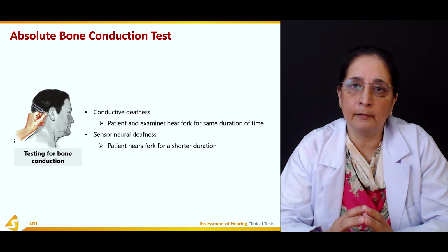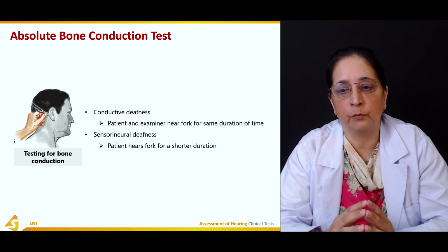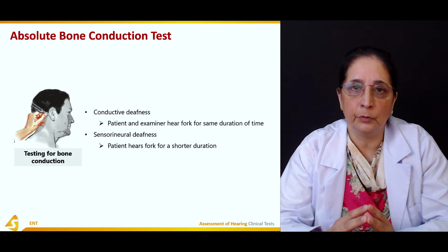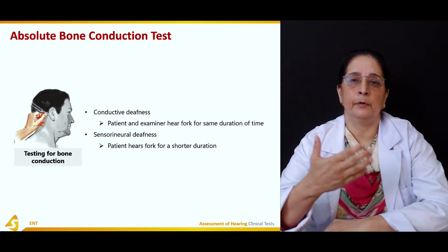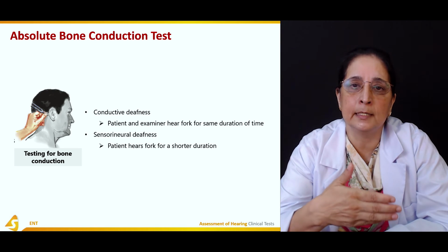And in sensorineural deafness, the patient hears the fork for a shorter duration. So it's a test performed between the patient and the examiner.